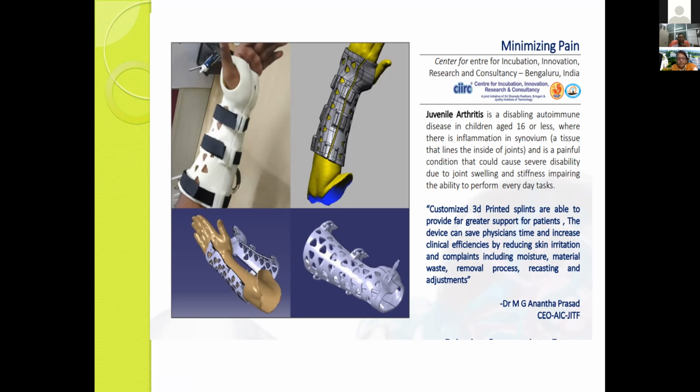That is the main thing. So directly you can scan hands or faces, or you can scan any model like a dental model. When you take the impression prepared from any of this material, and it is in your hand, because every dentist is not going to have this kind of scanning device, this is a way out: you take the impressions and they go to the laboratory, and you scan it and prepare the things for those specific cases.